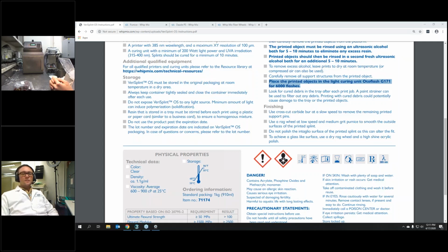The other thing is most of the curing is already done at this point. So you're really just doing that final outer cure to get that outer surface to where it needs to be for biocompatibility, and also a little bit on the strength for the entire appliance, but you're not getting much shrinkage effect from the actual post cure. Yeah, it's just a surface cure that we're actually completing with this final cure process.